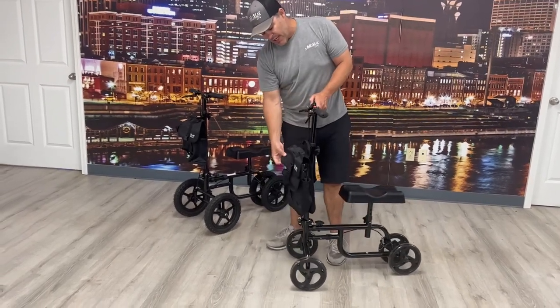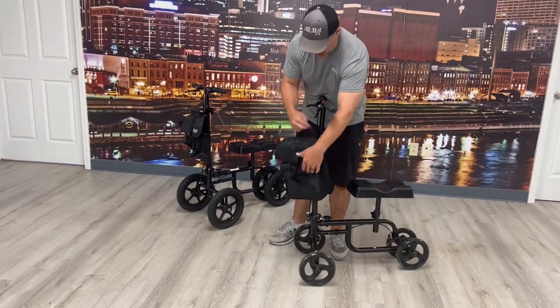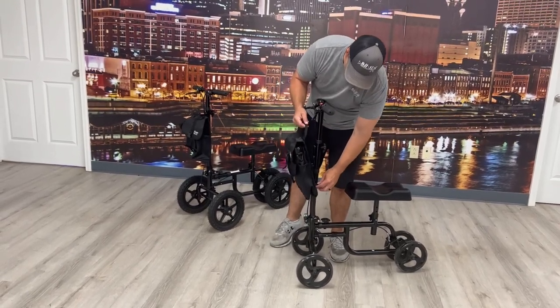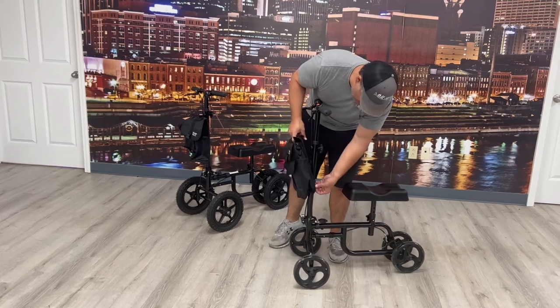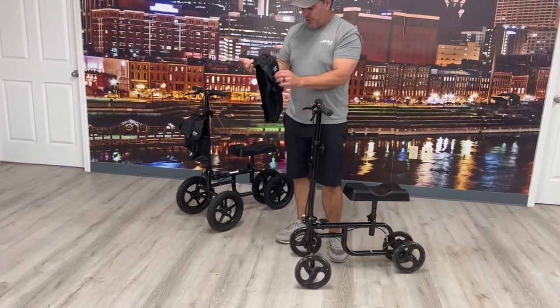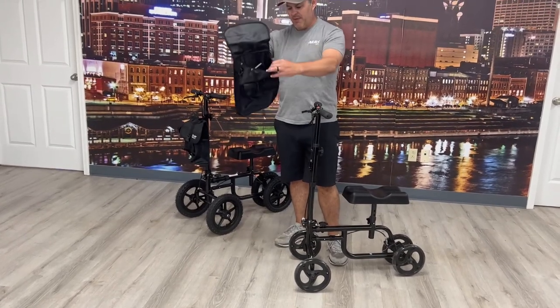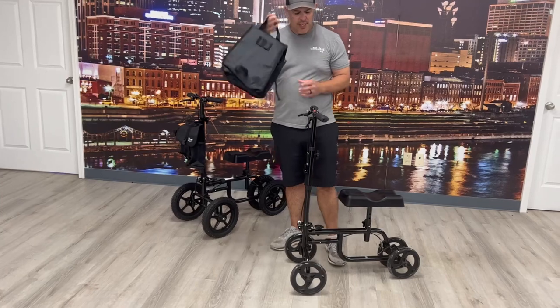You'll notice there is a pouch on the front that can come off — it's velcro around here. I'll show you how it comes off real easy. It also has a little carrying pouch so you can carry stuff in there, put your drink there — a nice little feature.